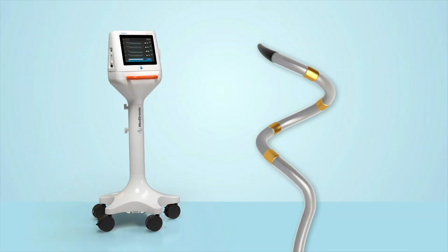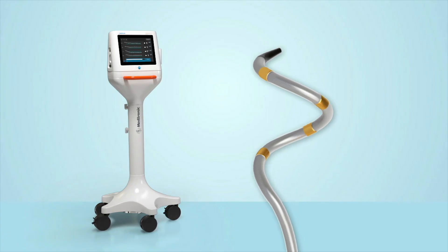The Simplicity Spiral catheter and Simplicity G3 generator from Medtronic, the pioneer of renal denervation.